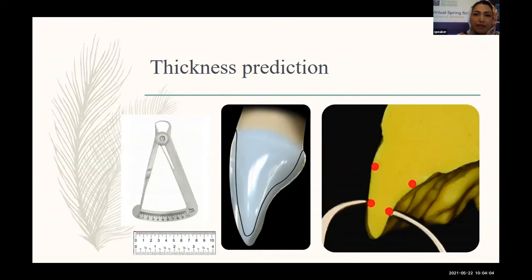If the thickness is less than 3.5 millimeters, the incisal edge of the preparation may be too thin to accommodate the milling bur. Of course, it depends on the milling bur diameter. So we should try to keep the incisal edge of the preparation as flat and as wide as possible without compromising the vertical height of the abutment.